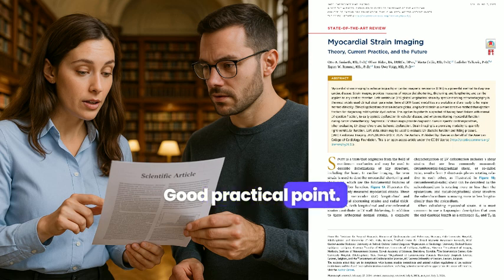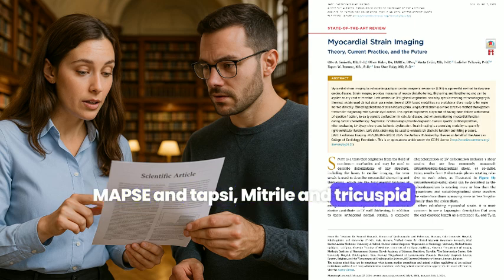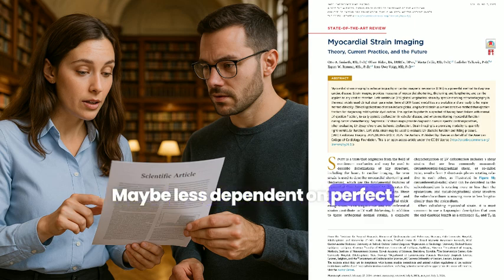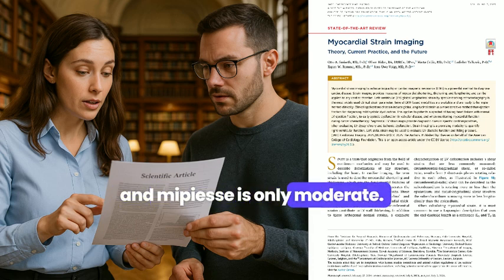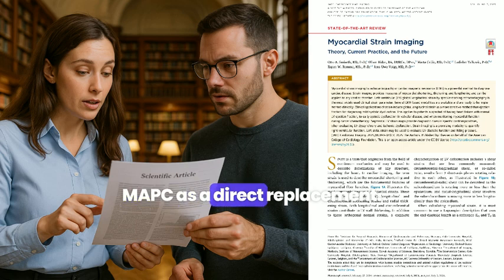Good practical point. How does strain compare to older things like MAPSE and TAPSE? MAPSE and TAPSE, mitral and tricuspid annular plane systolic excursion, are simple M-mode measures of longitudinal function. Often easier, maybe less dependent on perfect image quality than GLS. But the correlation between GLS and MAPSE is only moderate, and there's just less clinical outcome data supporting MAPSE as a direct replacement. So not quite interchangeable.